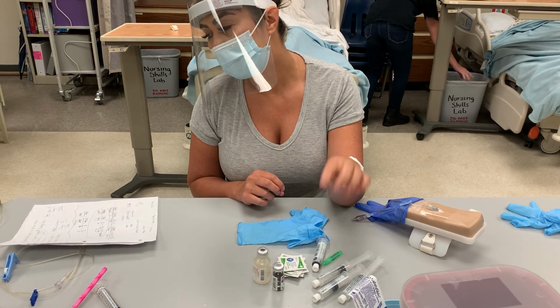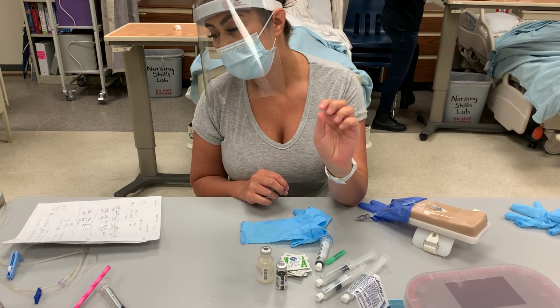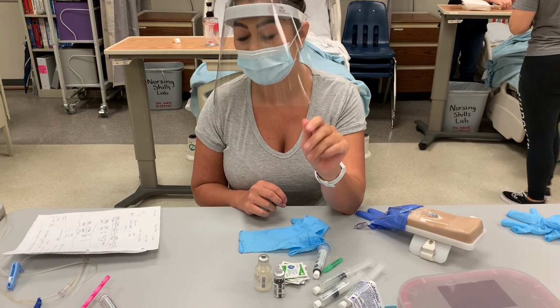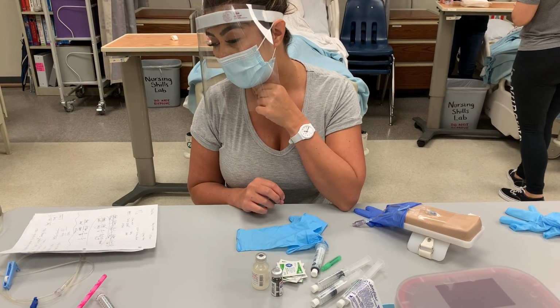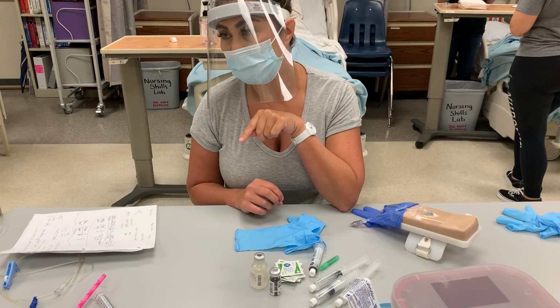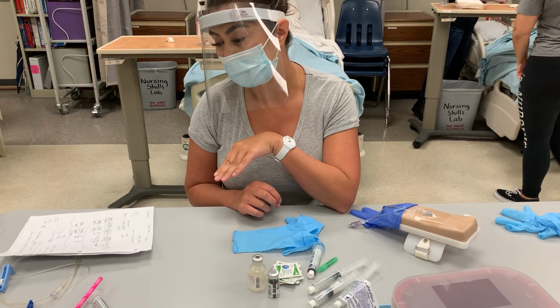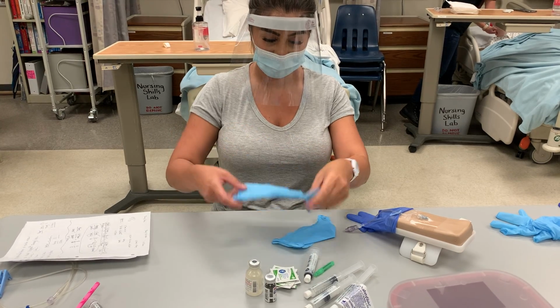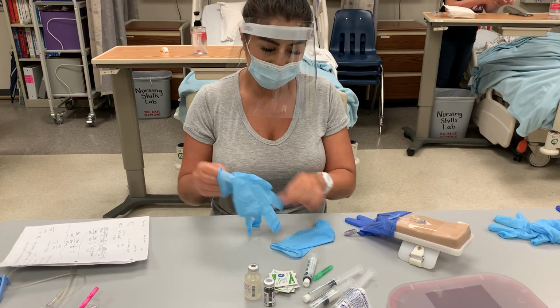And I'm going to be pushing that over 4 minutes, and I'm going to do it in 30-second increments. So that would be a total of 0.75 mLs every 30 seconds. That's how I'm going to push it. So I'm going to go ahead and get started. Oh, I don't need these yet.